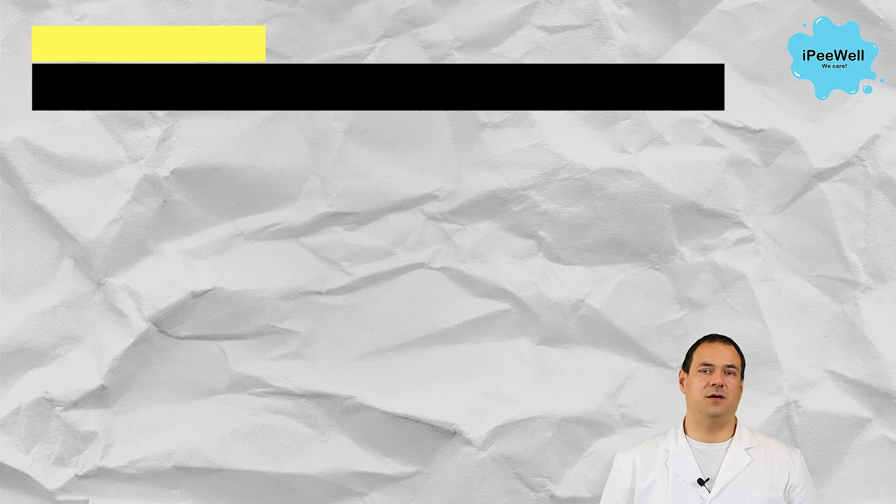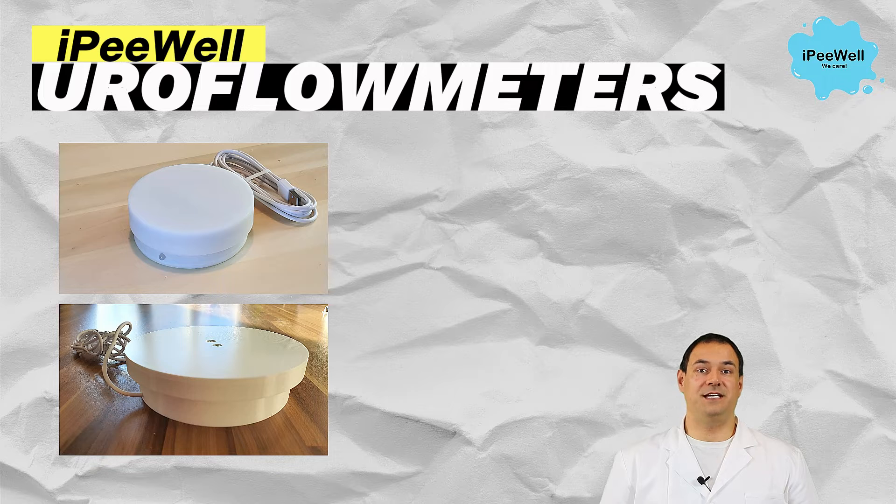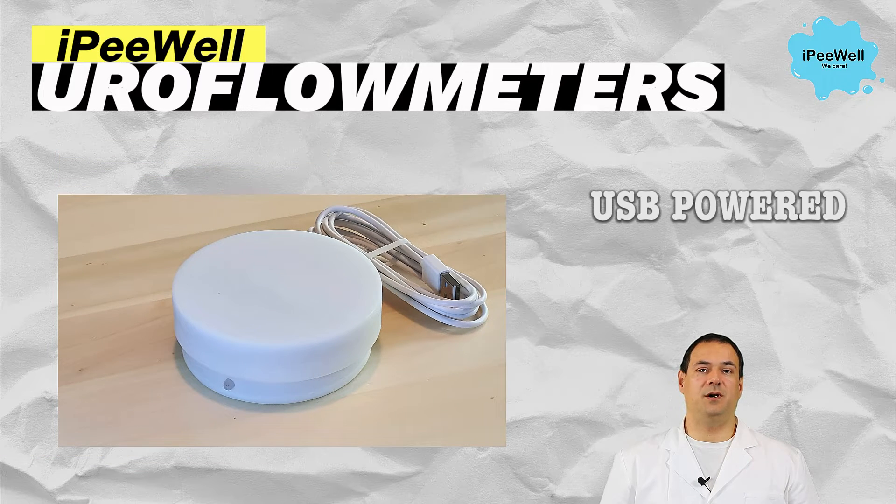Uroflometers come in different types. Here's an example of a cutting-edge home uroflow device. It's a USB-powered portable device that offers convenience and accuracy, making it an ideal choice for personal use.